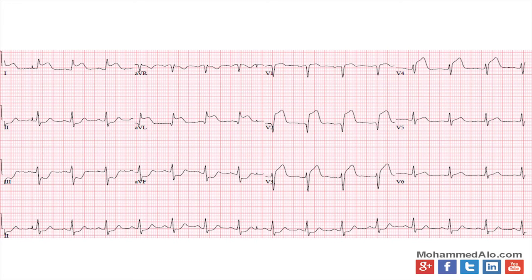This could be a left main occlusion. If your left main is occluded, that occludes your circ and your LAD. And that is probably what's going on here. The fact that V1 is a little elevated, AVR might be a little elevated, kind of all leads you to believe that it's a left main occlusion or just some very proximal occlusion.